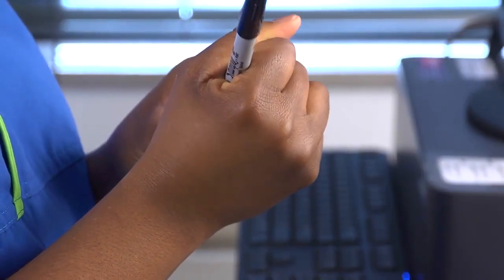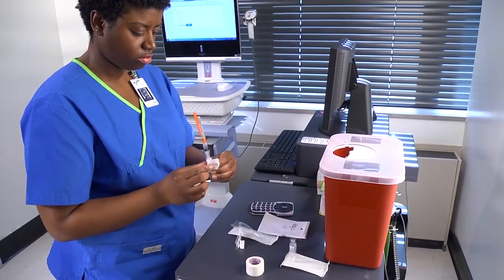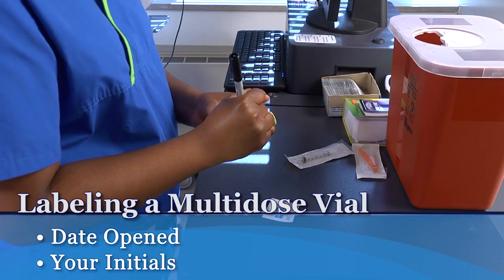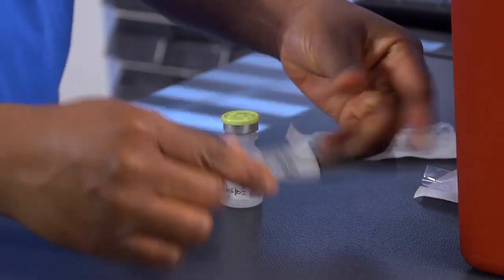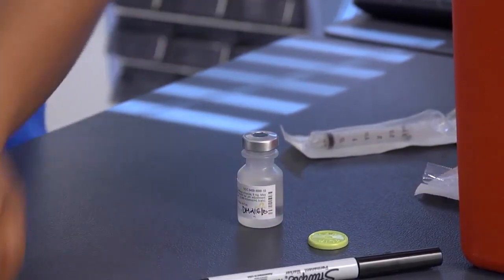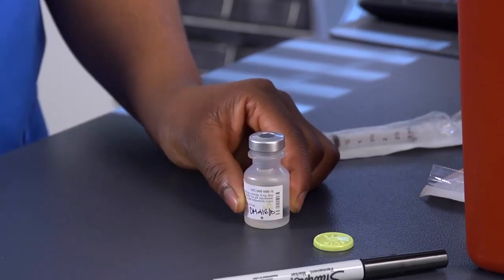If you're preparing the medication away from the patient's bedside, clearly label the syringe with the name of the medication and the dose in the syringe. When you open a new multi-dose vial, write the date and your initials on the label, and then swab the rubber seal. If a multi-dose vial is already open, wipe the surface of the rubber seal with an alcohol swab and let it dry. Discard single-dose vials after use, even if there is medication remaining in the vial.